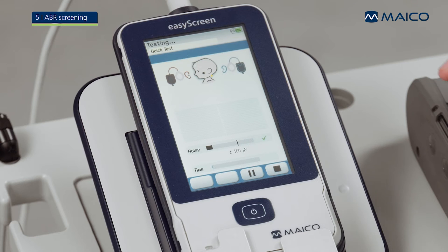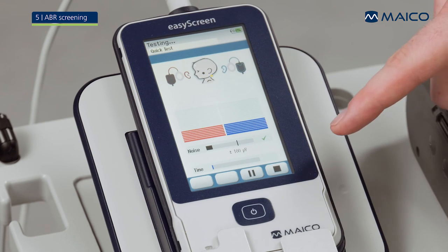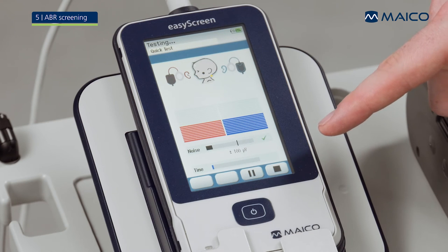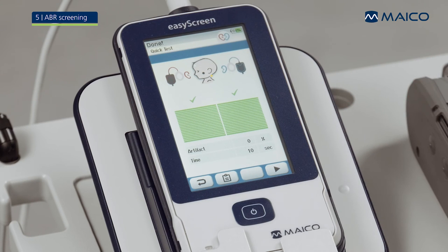The test progress is displayed in a bar graph for each ear side. A noise bar below the graph provides feedback about the measurement quality and electrical noise. When the screening is complete, an overall result of the test will be displayed on the EZ-Screen.